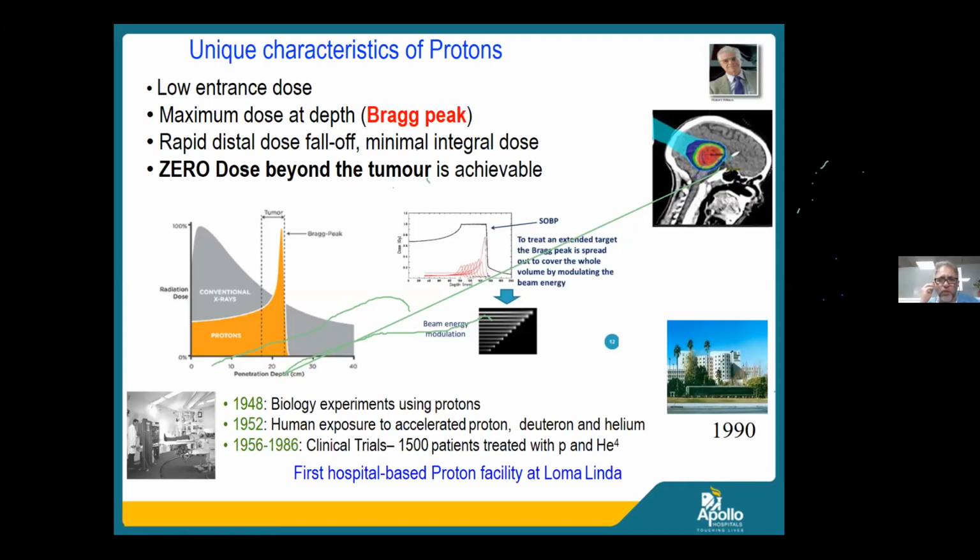So the ability of the radiation oncology and medical physics is such that you devise your radiation plans in such a way that these Bragg peaks are delivered in such a way that you conform the proton beam along the shape of the tumor or the target, as we say, which includes the microscopic extension of the tumor, and try to limit the radiation dose, not only the high dose envelope, but also the low and intermediate dose envelope, significantly better than we have with the photons.